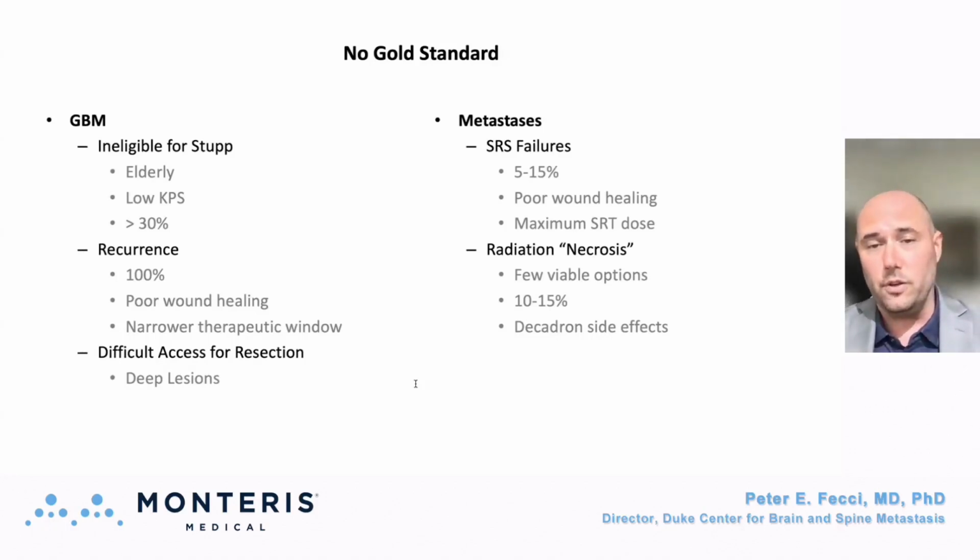There are further issues here in that an open resection may provide challenges due to poor wound healing, as well as a narrower therapeutic window, i.e. benefit versus risk, because these patients potentially may be more fragile, and there are challenges to the surgeries themselves in those instances, as well as additional scenarios where lesions may be difficult to resect because they're more deeply seated, but you can get a biopsy needle down there, which means you can get a laser catheter down there.